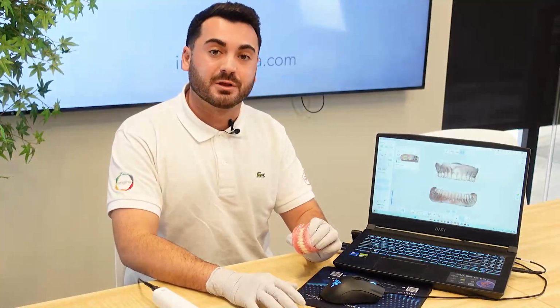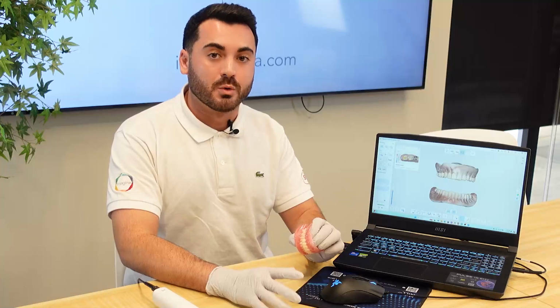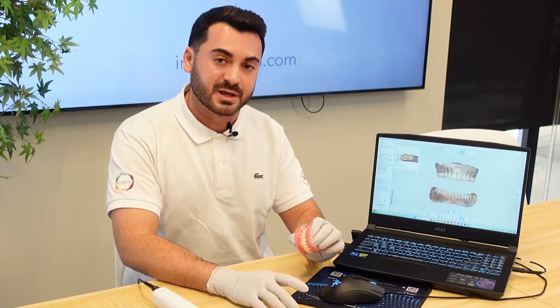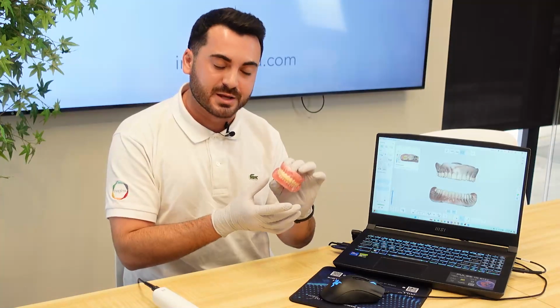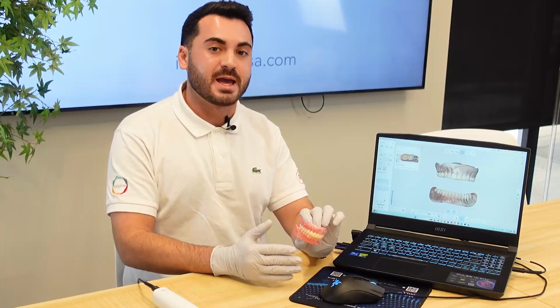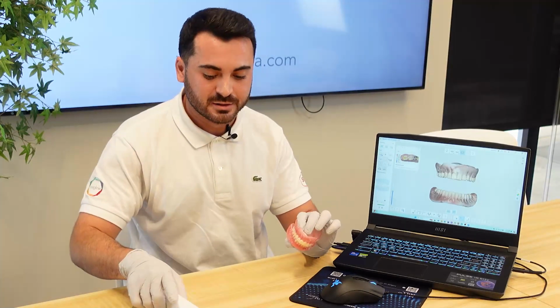Once I finish scanning the lower denture, we can then move on to doing the bite scan. For the occlusion, I always recommend that if possible, the patient wear the denture in the mouth during the scan. Otherwise, make sure that the denture is firmly held in place in the correct bite, and we're going to want to implement a zigzag motion, scanning at least 3 to 4 teeth on the posterior of the buccal side.